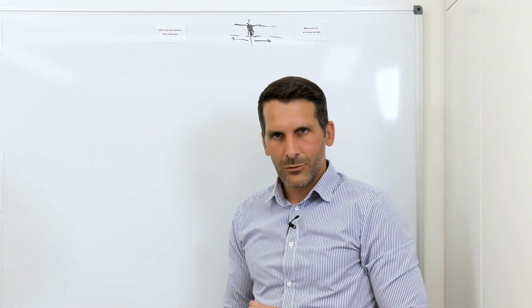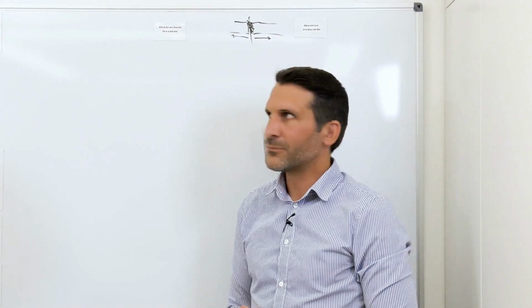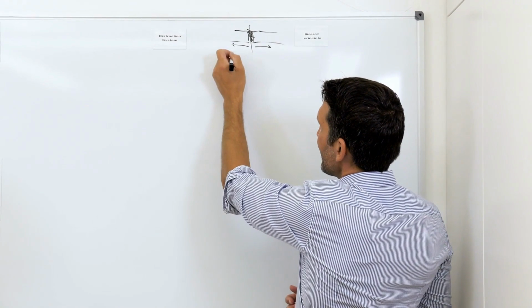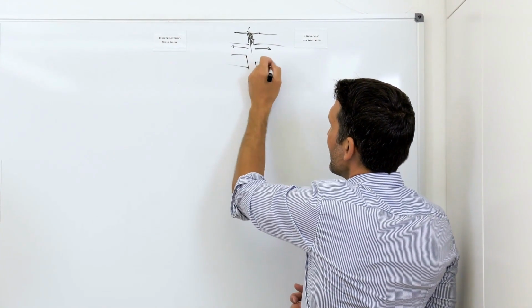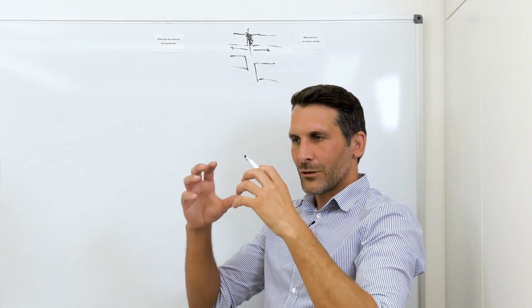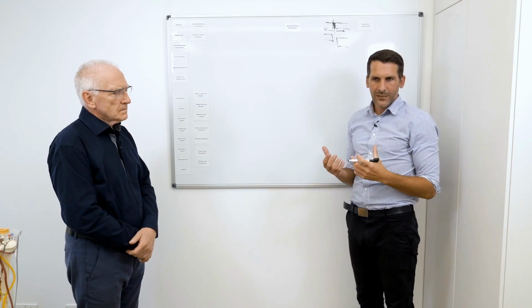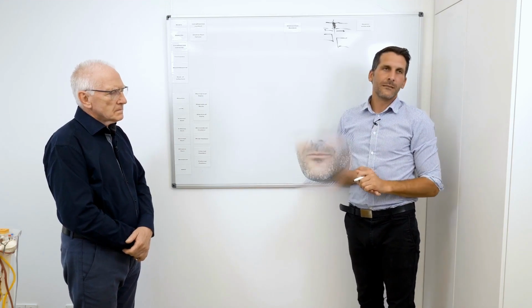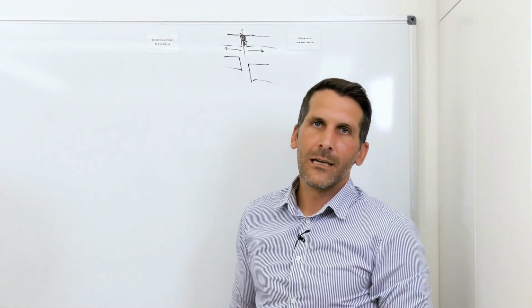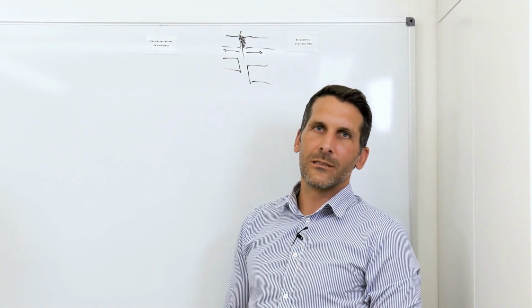The problem here is not the defined speed and the pulling apart, but the problem is stabilization. Because these two ends of the bone must not end up like this. The three-dimensional direction during the pulling apart must be maintained. Otherwise, you either have a step in this bone, or you tend to have bow legs or knock knees, or you basically have a misalignment, and that must be prevented.